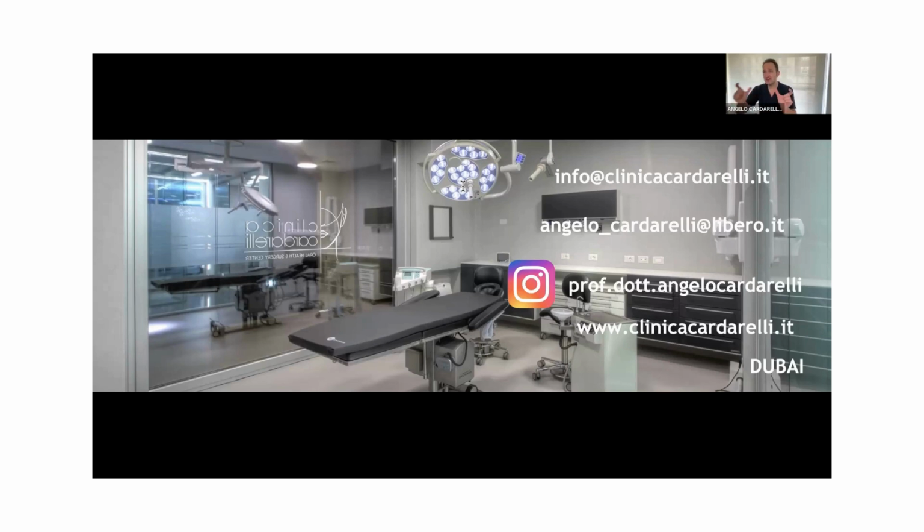I did different cases to compare immediate and delayed loading, but you can do immediate loading as with standard implants. So why did you wait 6 months on the first patient you presented, on the right side? Because I wanted to be sure to avoid some lateral force during the loading, in order to avoid any micromovement, and to wait for the osseointegration of the screw.